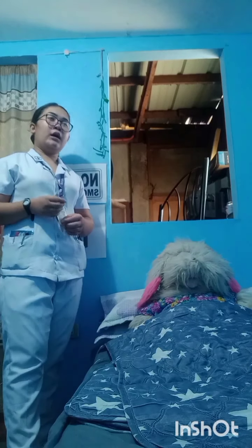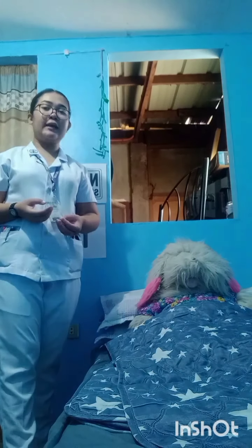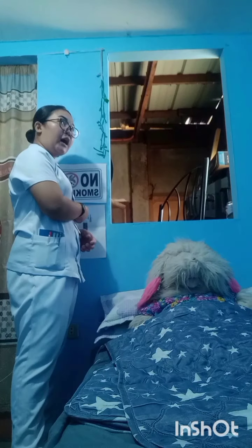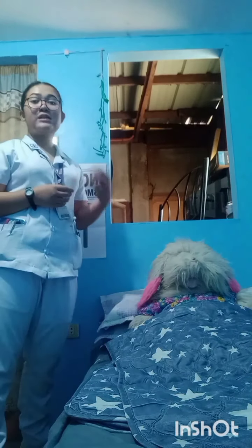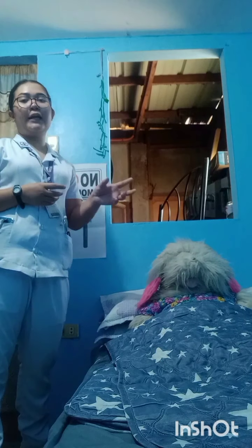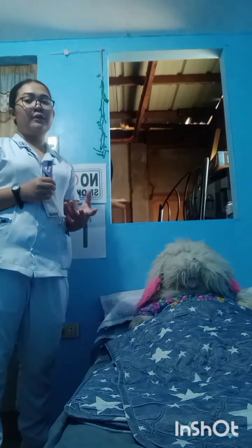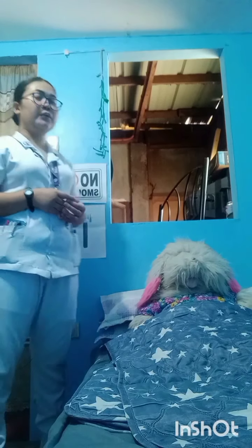And, flow meter should be in off position. Kasi, kailangan siyang off position pag i-attach na natin siya sa ating oxygen tank or sa ating wall outlet, para hindi masayang yung oxygen, hindi agad lalabas. Next is we're going to fill the humidifier bottle if needed.